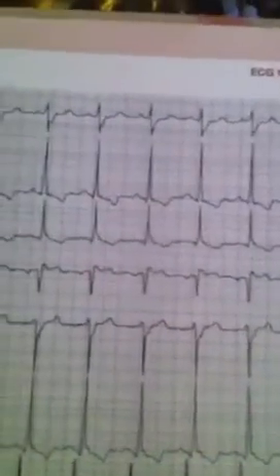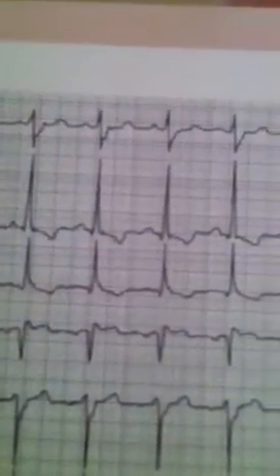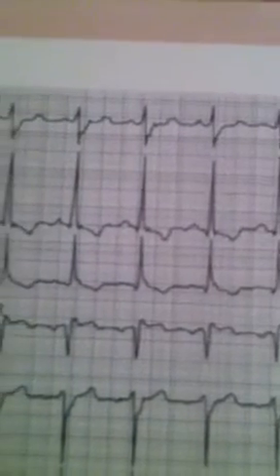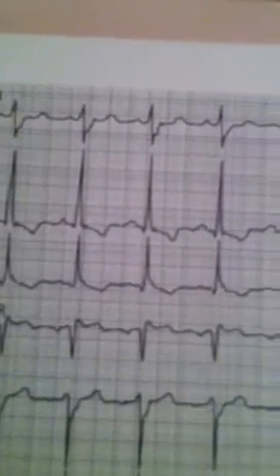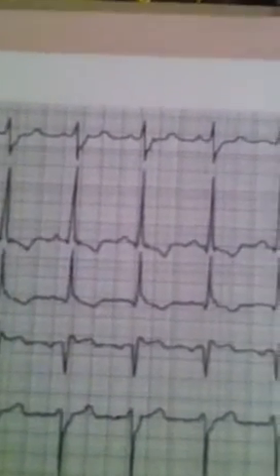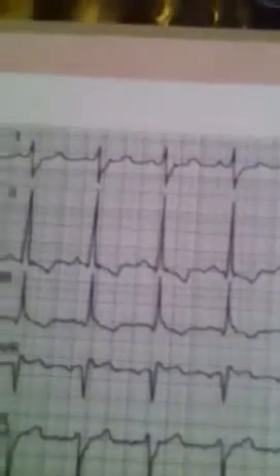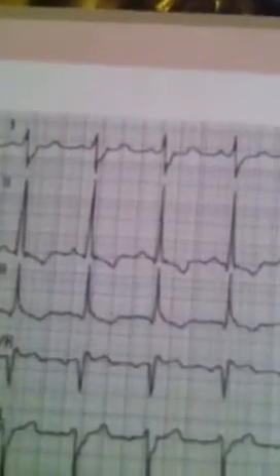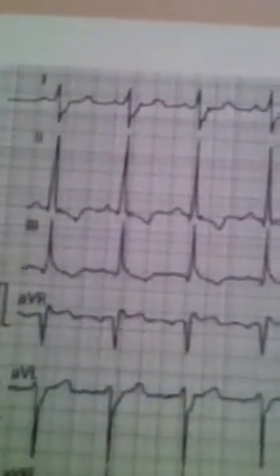Looking at this ECG, there is a P wave and QRS — this is a regular sinus rhythm. However, there is a wide S in lead one and a tall R in lead three.